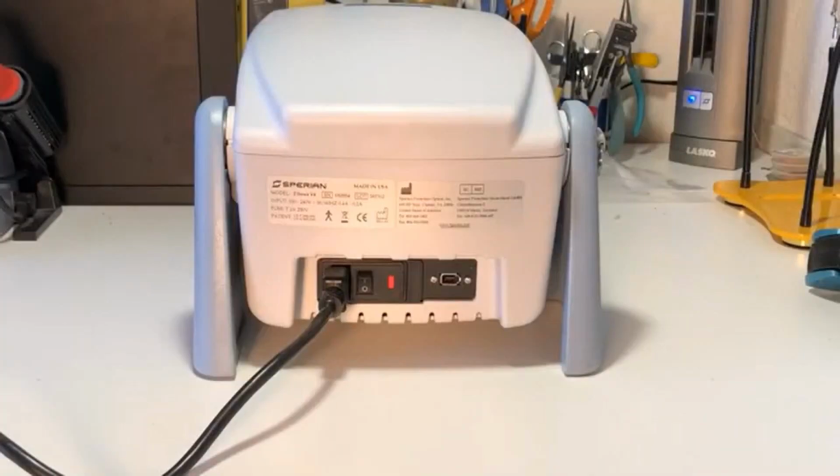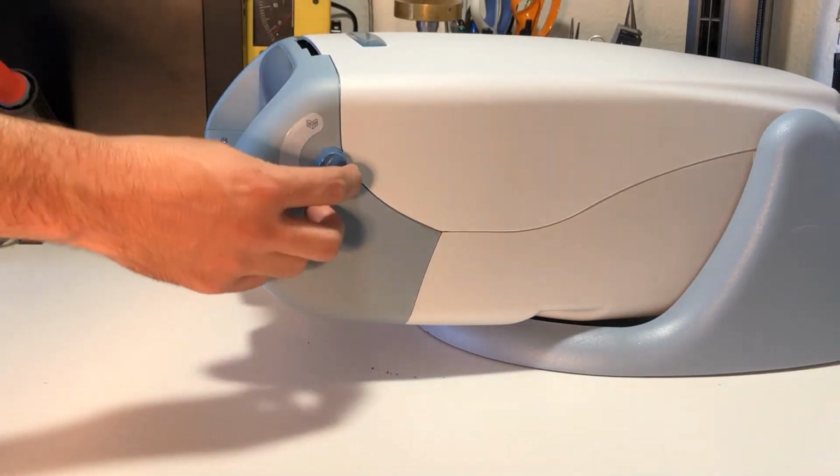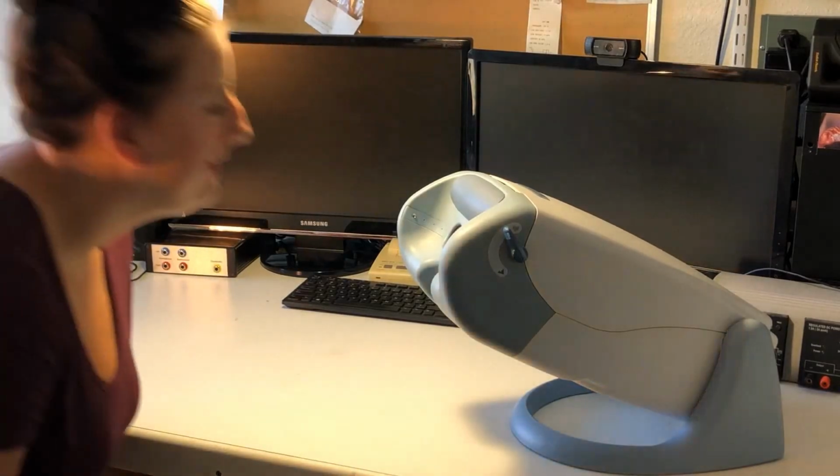To begin, flip the switch on the rear of the unit to the on position. Then, turn the near far switch to the far position, pointing towards the mountain. Have the patient look into the vision screener.